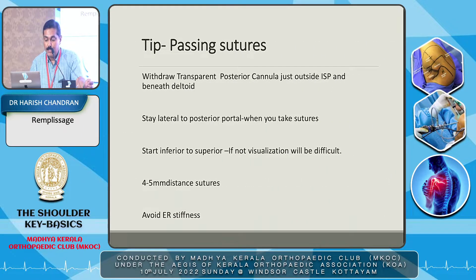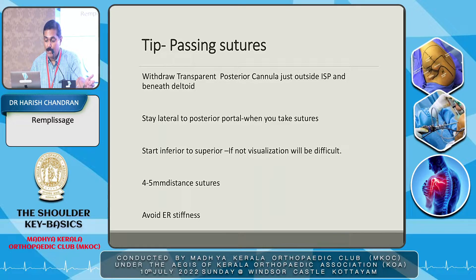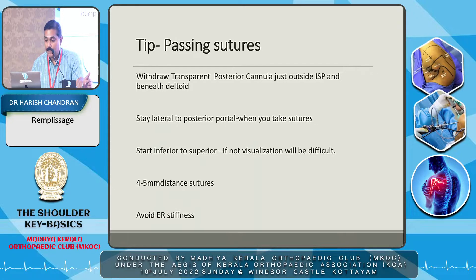Don't take too large a bite as that may cause external rotation stiffness of the infraspinatus. When passing sutures, once the anchor is placed, withdraw the cannula back and stay lateral to the posterior portal. Start inferior to superior — if not, visualization will be difficult. Maintain a 4–5mm distance between sutures, and don't take a very thick bite of the infraspinatus.